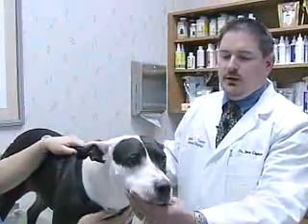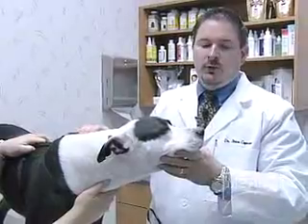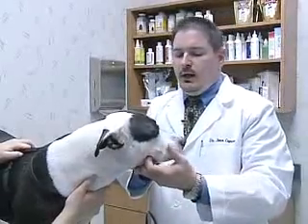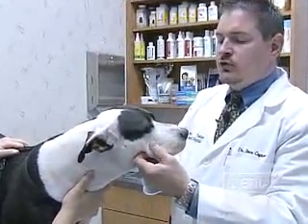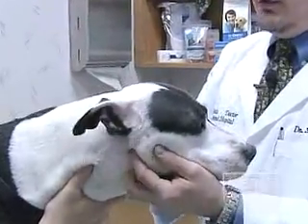This is Wauquita Efford, and this is Ty Efford. Wauquita is going to be having a dental cleaning today. The first thing I like to start off with is doing a thorough oral examination. We check facial symmetry and feel the muzzle below the eyes, making sure we don't feel any unusual swellings, and checking the TMJ joints and the muscles of the jaws to make sure everything's working well.